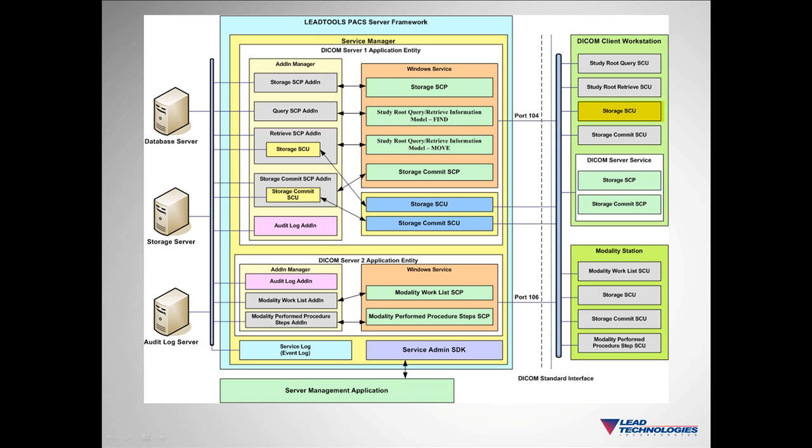Once a DICOM client issues a command such as a store, the command along with the dataset is sent to the DICOM server, who in turn passes it to the storage add-in. The storage add-in then performs the action by inserting the information into a database or communicating with another PACS or doing whatever the user has coded.